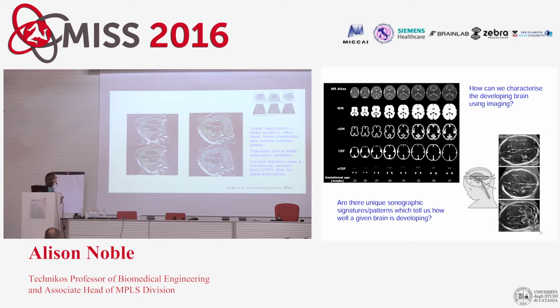As you can see, if you do it frame by frame, it's jumping around. Frame by frame methods often do. It does actually get a lot of the labels right, but it is moving around. And what the temporal version of that does is it starts to work much better.